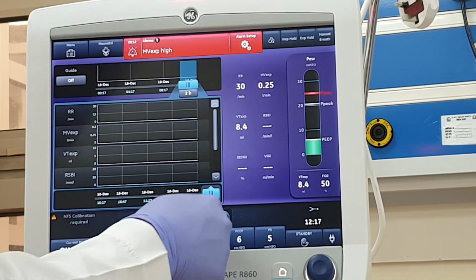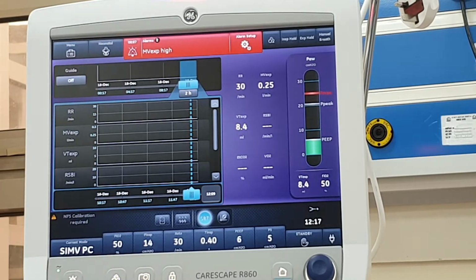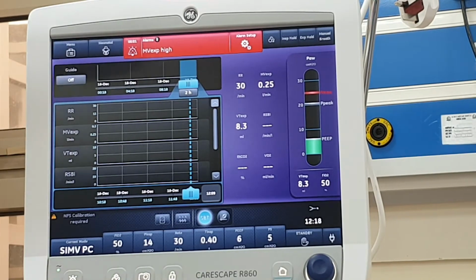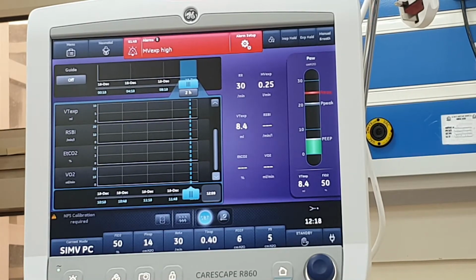With the future, we have the SBT trial. You could evaluate your rapid shallow breathing index, the RR of the patient, see the trends. Is the patient trending up toward tachypnea, or is the patient towards steady generally? And so you could understand a lot about the patient. I remember sometimes you need to sit beside the patient to understand many things, but now with those technologies, you could know a lot about the patient just by standing beside the ventilator for 2 to 5 minutes.